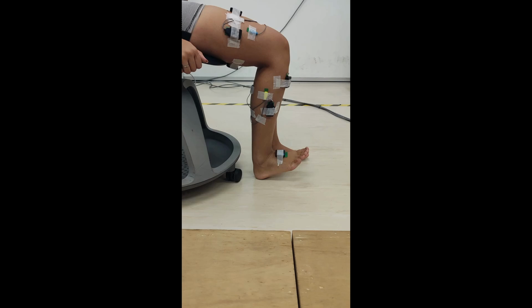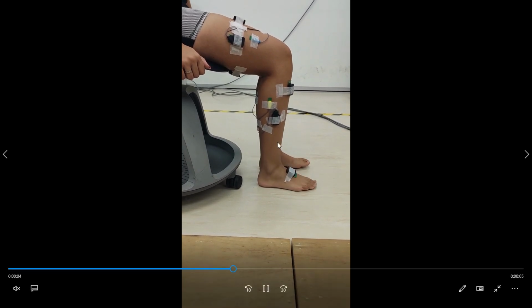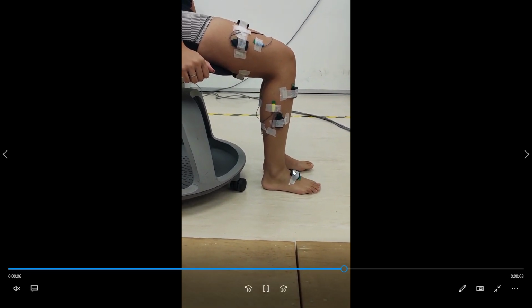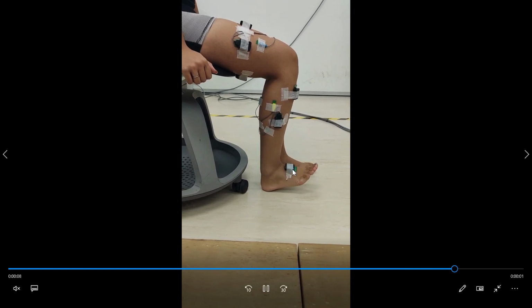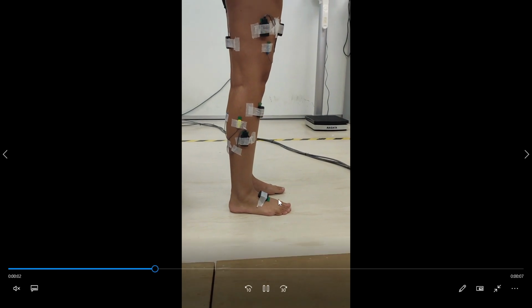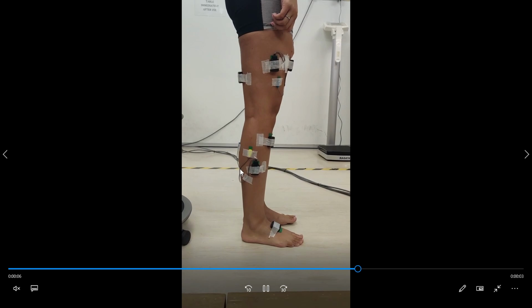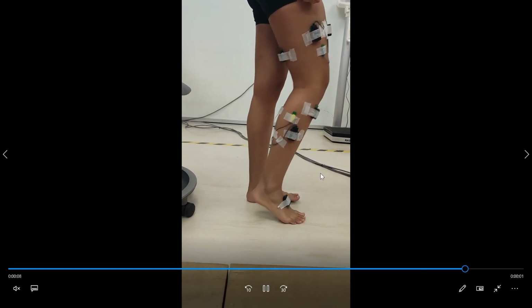Traditionally, it's good practice to collect the MVC before you start motion capture trials so that the subject is not tired. In this case, we are collecting the MVC for the tibialis anterior, which is this muscle over here, by asking subjects to maximally contract their ankle, which is dorsiflexion. And in this one, we are asking them to tiptoe as hard as possible to collect the MVC for this muscle over here at the back, which is the gastrocnemius.